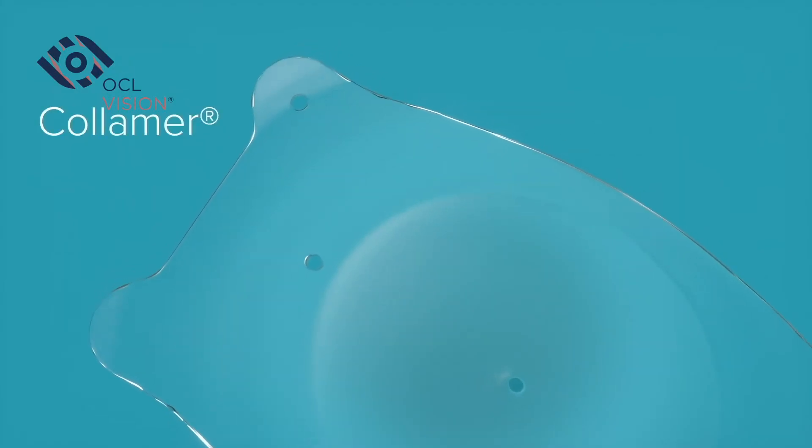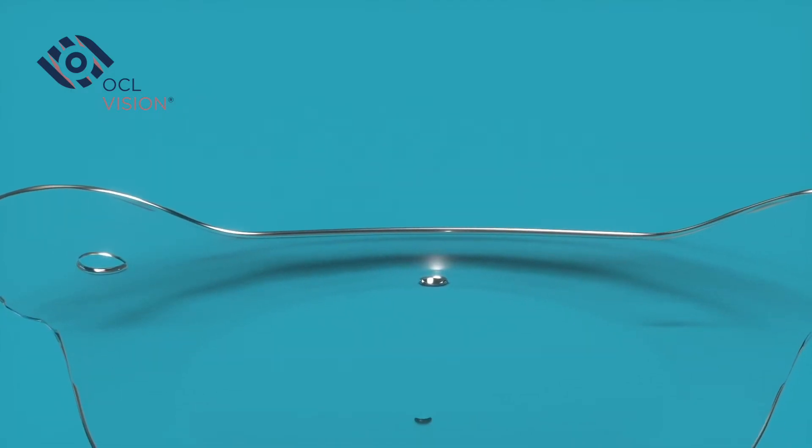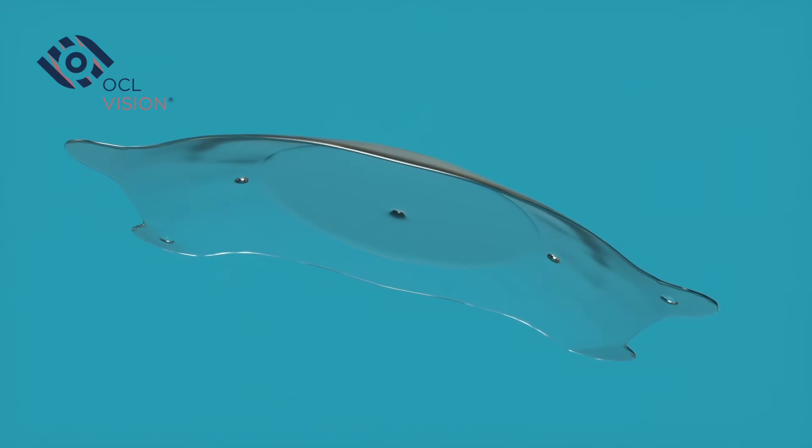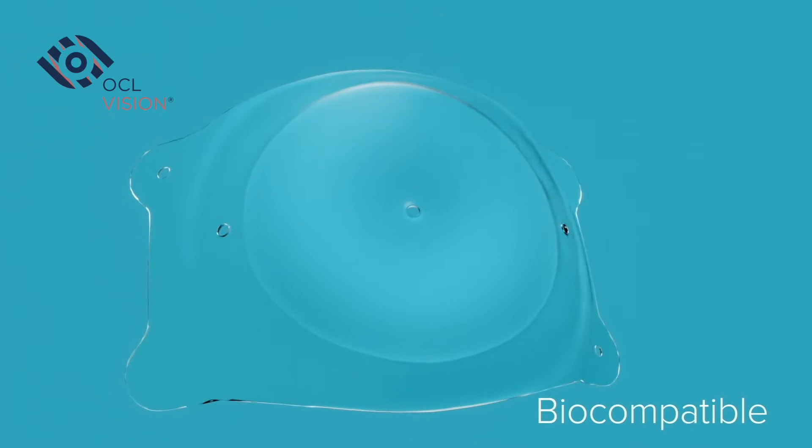EvoVision ICL's Collamer material contains a small amount of purified collagen, and the remainder is made of a similar material to that found in soft contact lenses. Collamer makes the EvoVision ICL lens soft, flexible, and biocompatible, which means the lens is stable inside the eye.